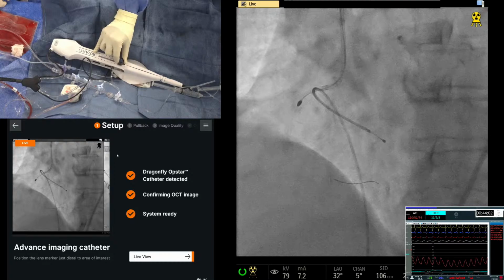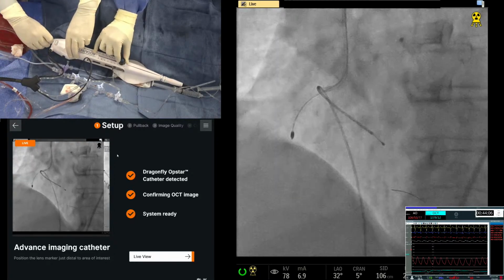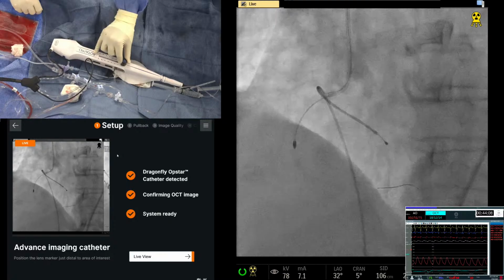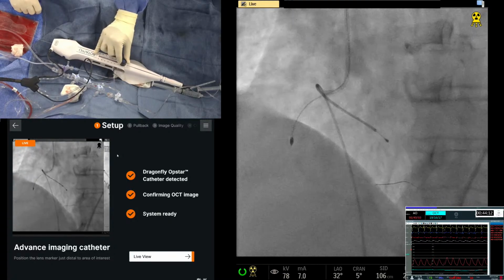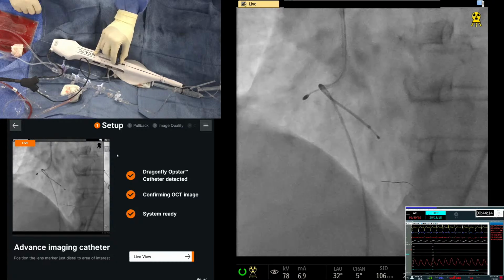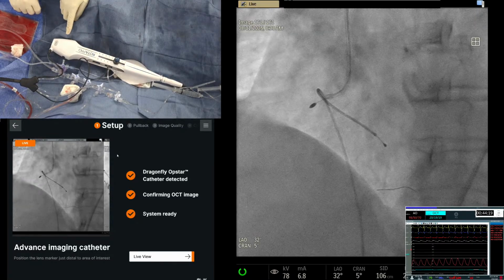You want to advance the wire further? Yeah. Okay, good. Nice. It made it. So I'm going to polish here. You see that? So that's done, right? Now what I'll do is we come back, we stop here. Now what we are going to do is do the same thing, Dynaglide, and we move forward, right?